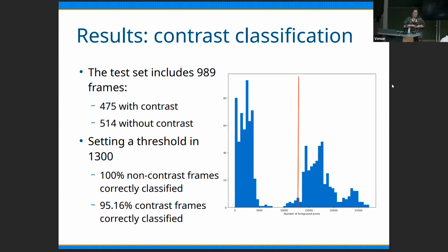I have a question. So you do a final manual correction. So you do several steps and then you correct manually, just for getting the training set. This is meant just, I mean, we have to do it once for training the U-Net, but then we wouldn't need to do it. How easy would it be, instead of having to do several steps and then correct manually, to do it manually from the beginning? Well, I think it gains much time. I mean, the corrections are minimal. And in case of manually delineating, we had to do it to generate the gold standard to compute the metrics, and it takes much more time.